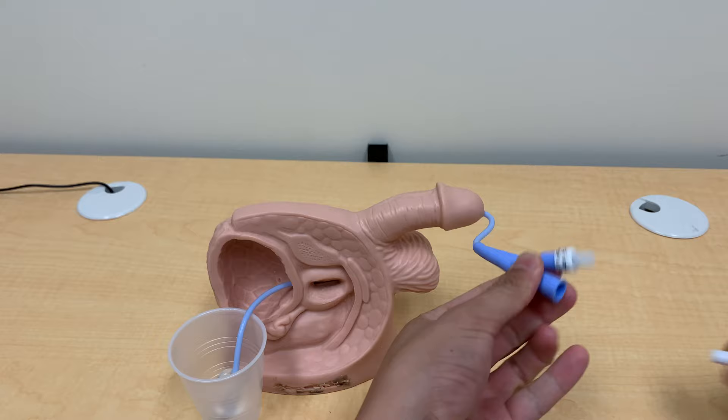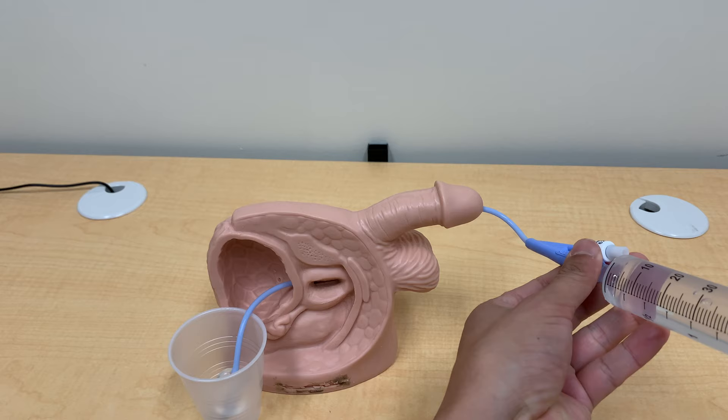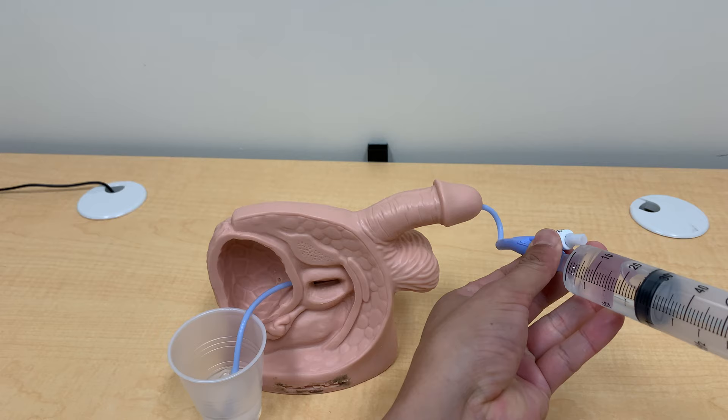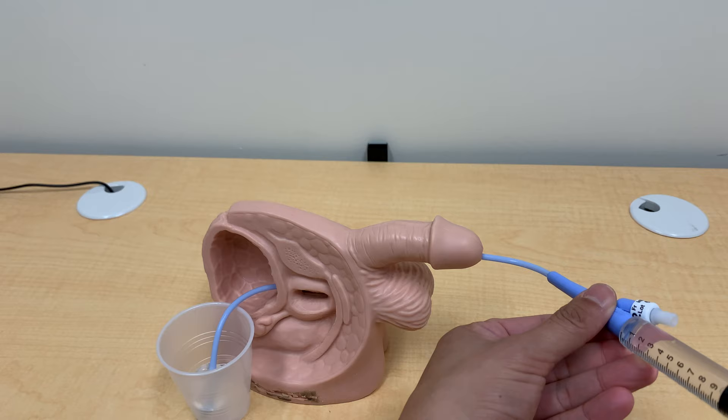Step one: unplug the catheter from the drainage bag. Step two: draw up some sterile water — about 60 ml. Step three: irrigate the catheter — push all 60 ml in, then pull back on the plunger and withdraw it all. This will suck out whatever is clogging it. If you don't have a 60 ml syringe but have a 10 ml syringe, you can use that as well — just make sure it's a tight fit so the water doesn't leak out.